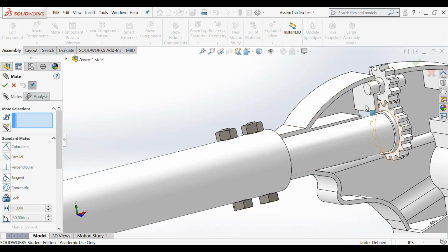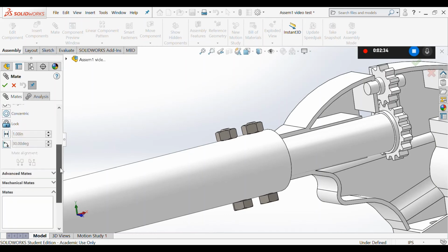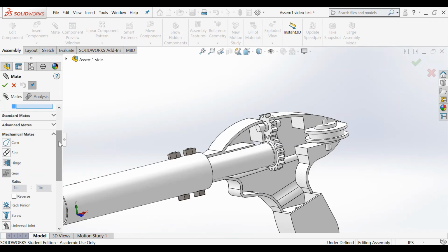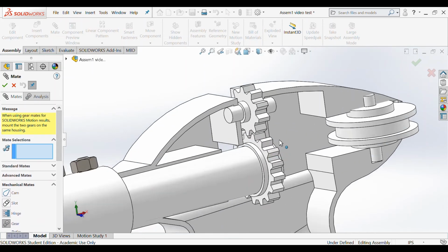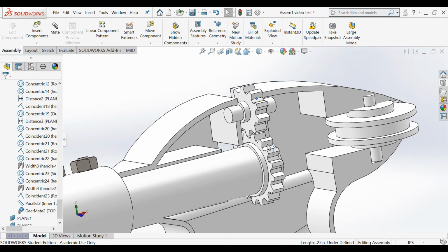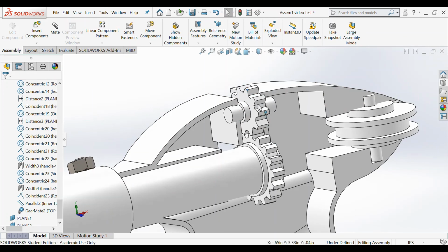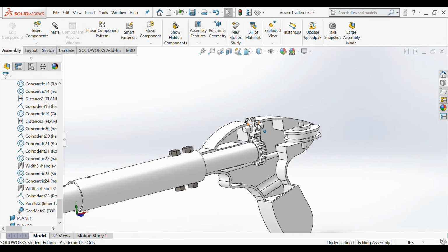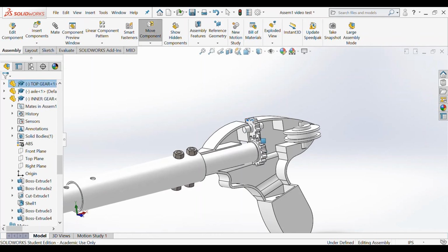Now that the teeth are not interfering, we're going to go down to our mechanical mates and choose gear mate. Now we're going to go ahead and zoom in, and we're going to click on this inner circle of the gear and this inner circle of the gear and see how they're selected, and we're going to go ahead and click that check mark. So now when we rotate this gear, they all move together. And as you can see, moving the gears moves the entire rod piece as well.